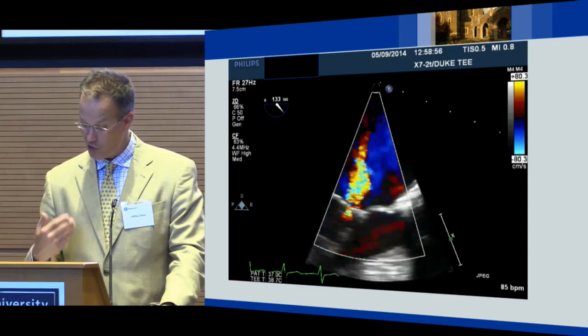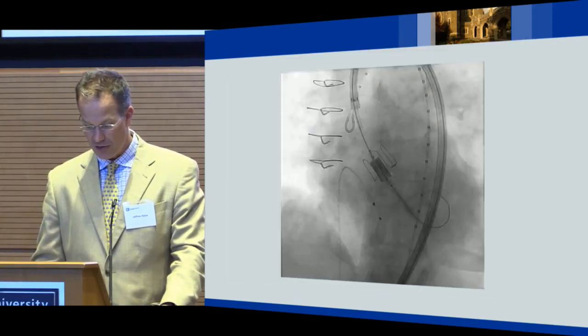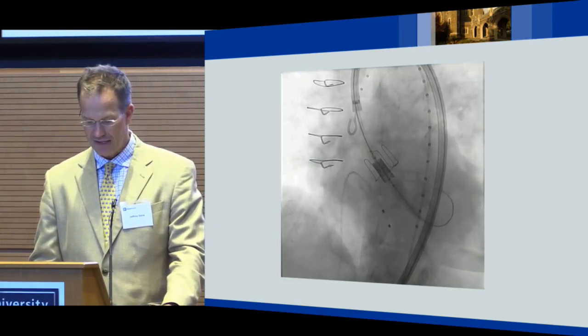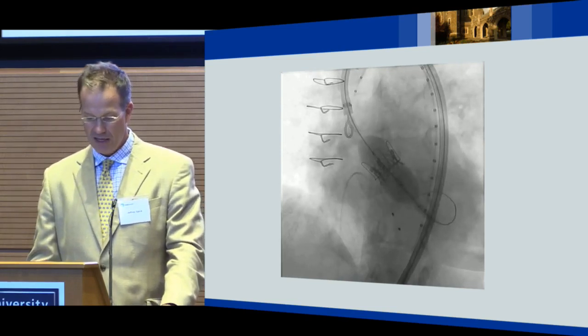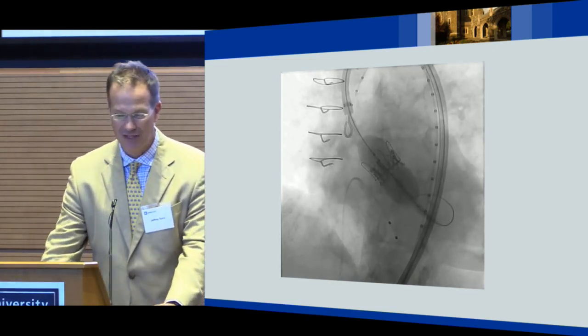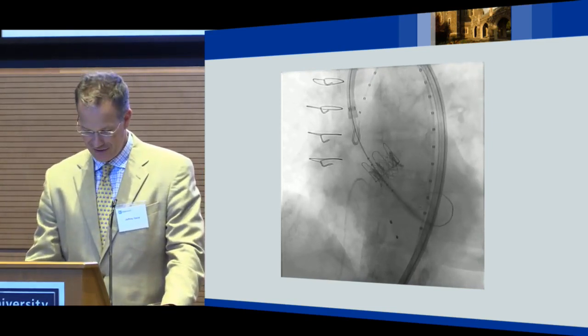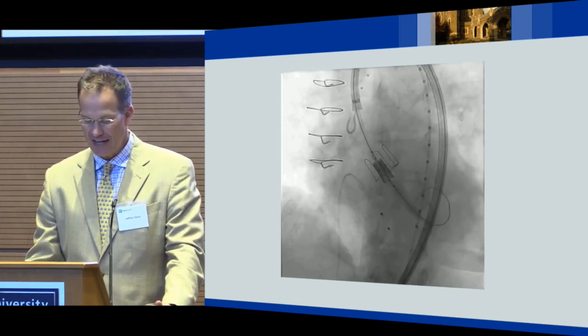So anyway, this is another shot of the MR. So we could go full speed and do the whole thing, or we could treat the aortic valve, and we thought treating the aortic valve would be the best choice, and this is how we treated it, valve in valve. And you can see here, this is actually a Sapien XT, and this is the valve stent frame. You can see here that each valve has its own distinct radiographic appearance, and that'll become important as you plan these cases.